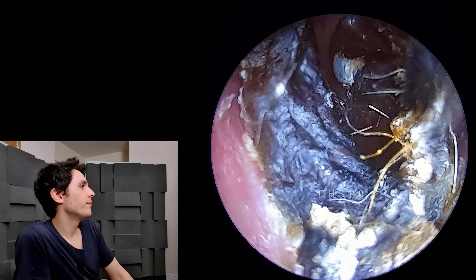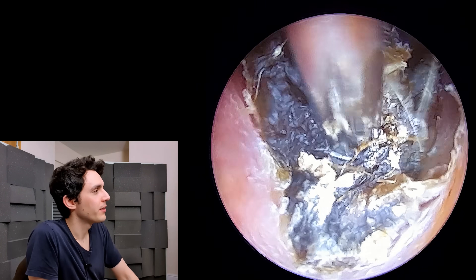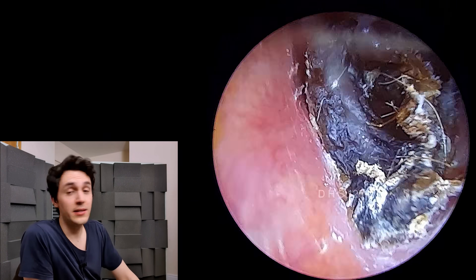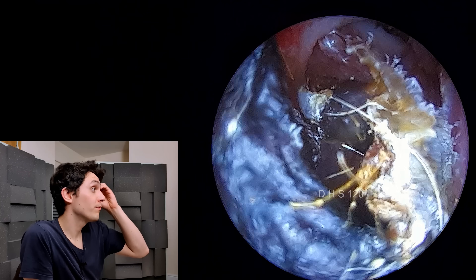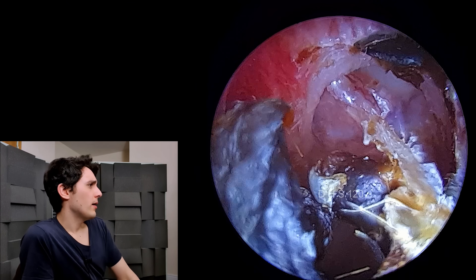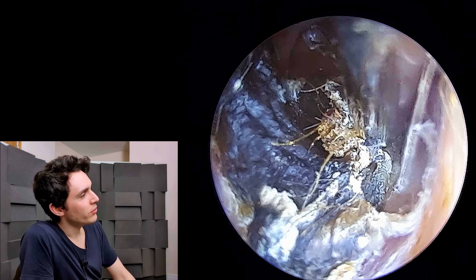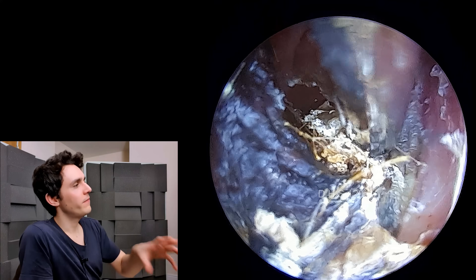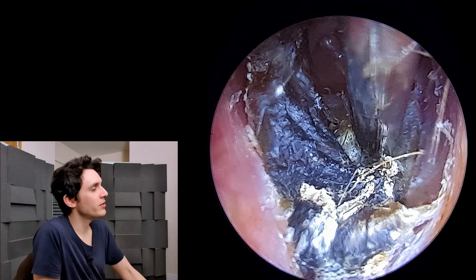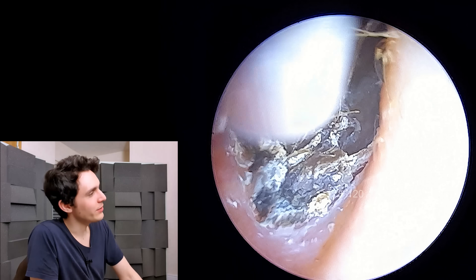In any case, because I can't really confirm the source of the bleeding, I'm going really really carefully here. There's also a fungal infection back there, so the removal of this debris is now indicated — it's not pointless. This is one of the longer videos I've uploaded to the channel and it's quite an interesting case because it shows a situation where there's a little bit of a struggle in order to remove this debris.